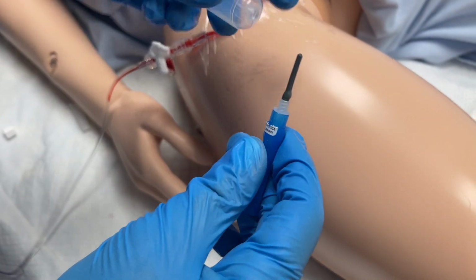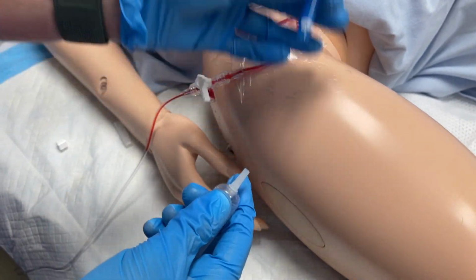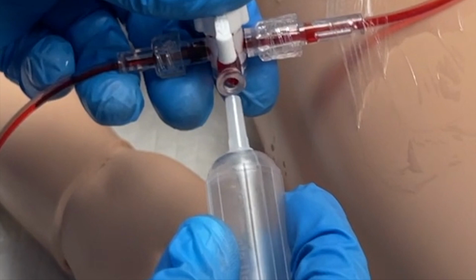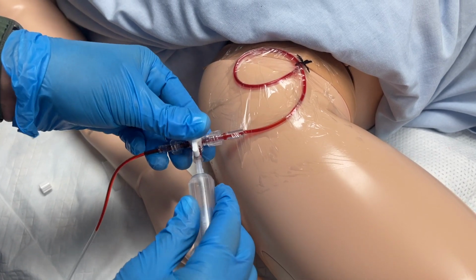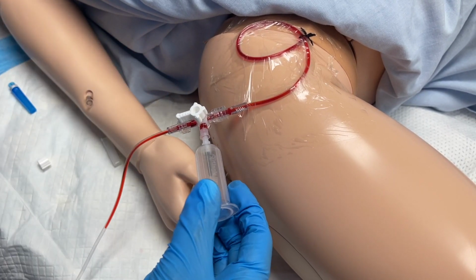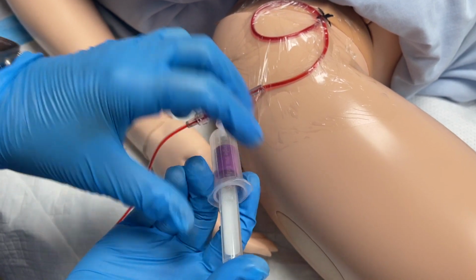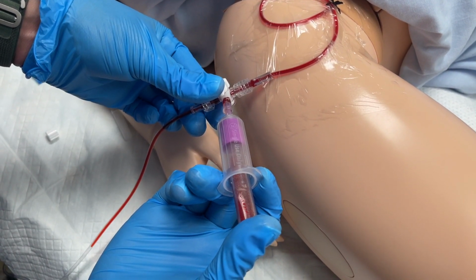Once the waste is discarded appropriately, you may then attach the tube transfer device directly to that open port. Today we're going to be using a slip tip connector. You will remove the cap from the tube transfer device and slide it directly in the open port. You will then turn your stopcock back off to the line, away from the patient. You will then use the appropriate order of draw to pop your tubes onto the transfer device.